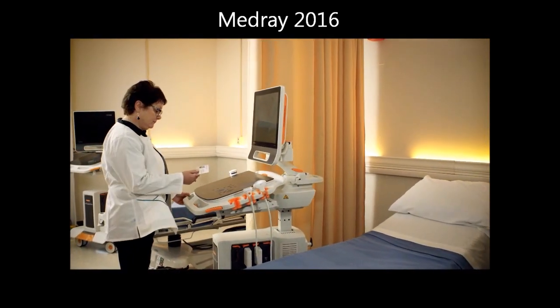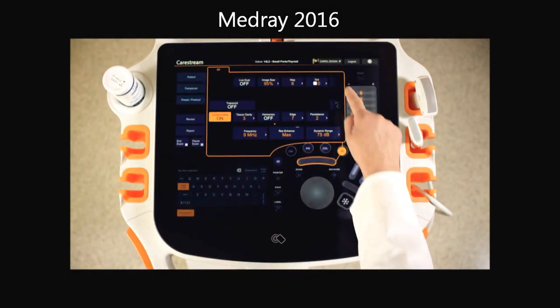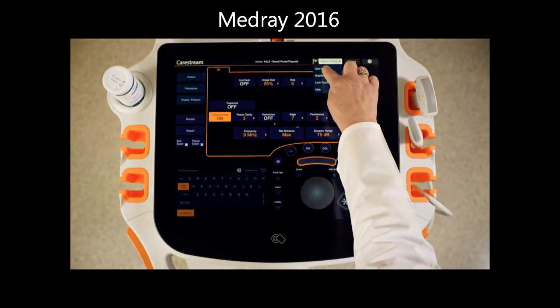A badge swipe securely accesses your personal preferences and controls. No more one-size-fits-all system.